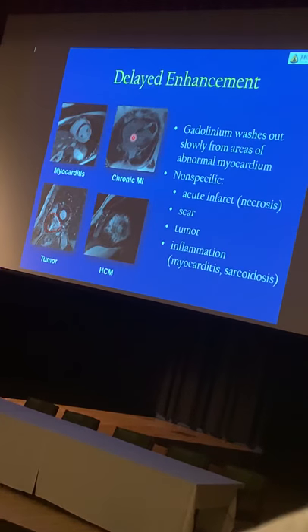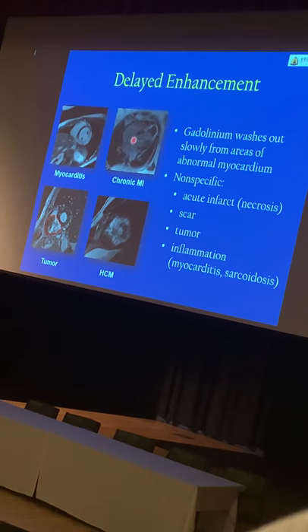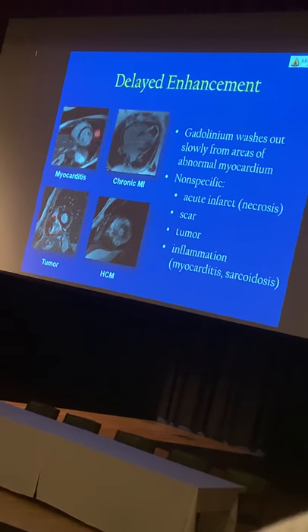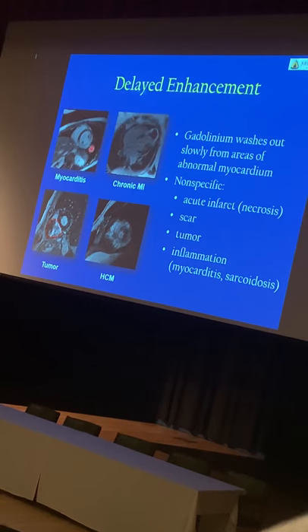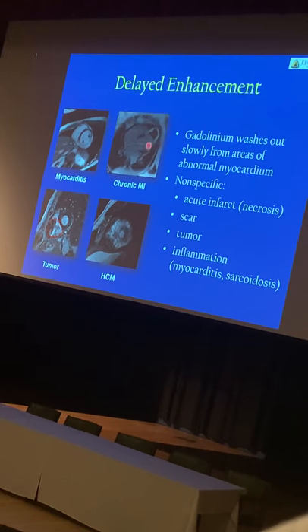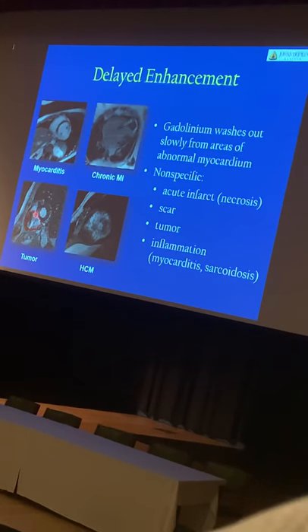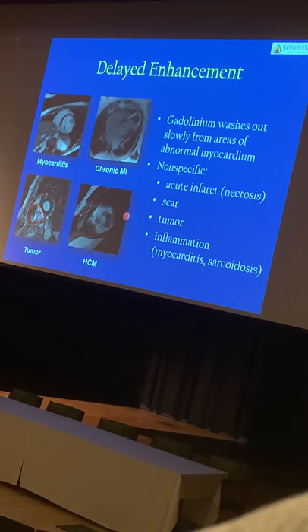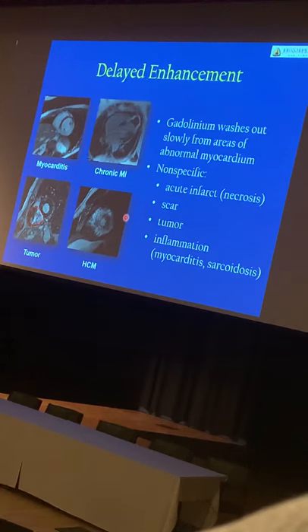Delayed enhancement is not specific for myocardial infarction. You can see it in myocarditis, in which we showed earlier that there was abnormal T2 or edema signal, and in the corresponding segment there's abnormal delayed enhancement. This is a patient with a chronic MI in which you see delayed enhancement at the apex and a black blob sitting at the apex, because the heart is not moving normally. Here you have a tumor, and here you have a very heterogeneous diffuse enhancement of the heart in a patient with hypertrophic cardiomyopathy.